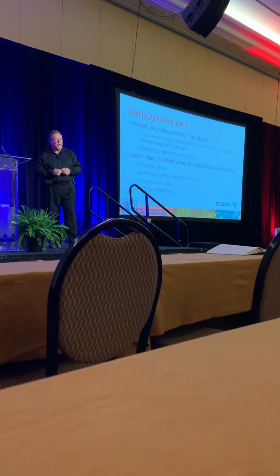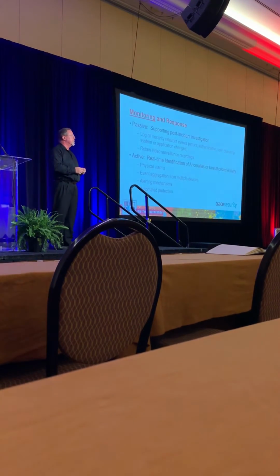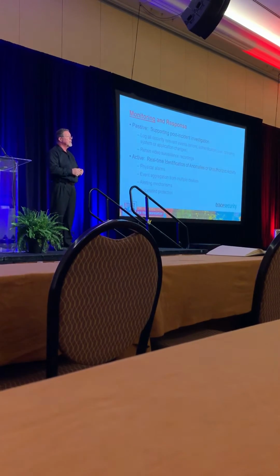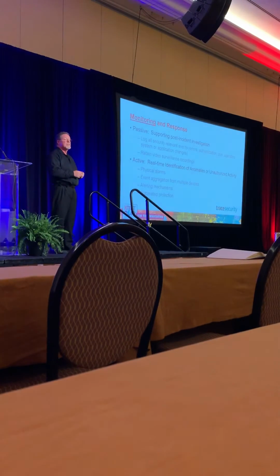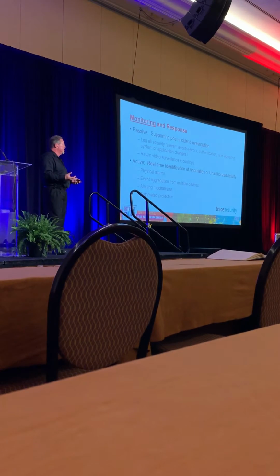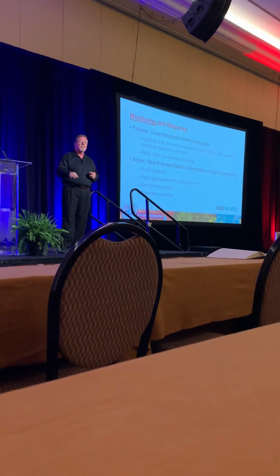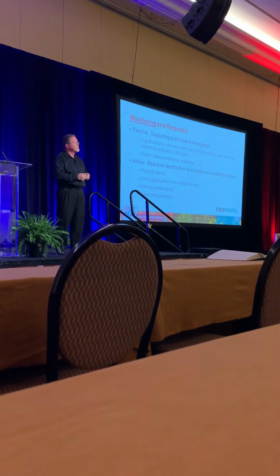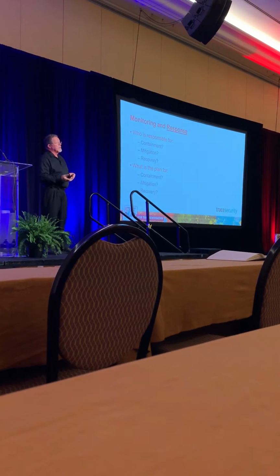So just a little bit more about monitoring. There's really two types of monitoring, and the one we described already is primarily passive monitoring, where you're collecting logs, you're collecting video surveillance. You basically want to have that information preserved so that you can go back and look at it later. But then there's also the active monitoring, where you get live alerts. The key point here is even if you install a system that may seem like a turnkey system, you're going to have to designate somebody to be responsible for responding to those events, to be able to both contain, mitigate, and recover.